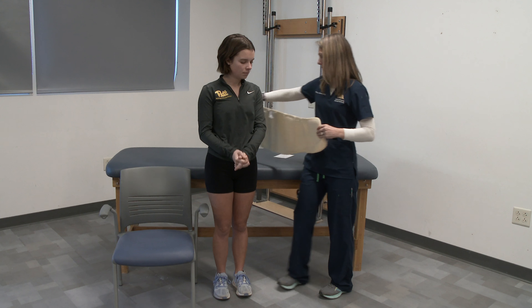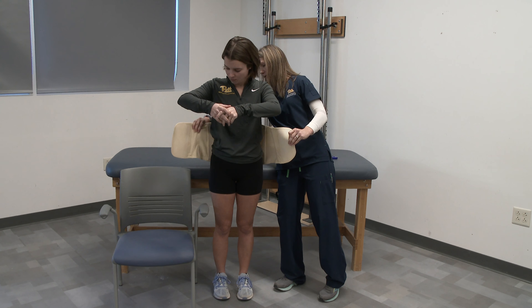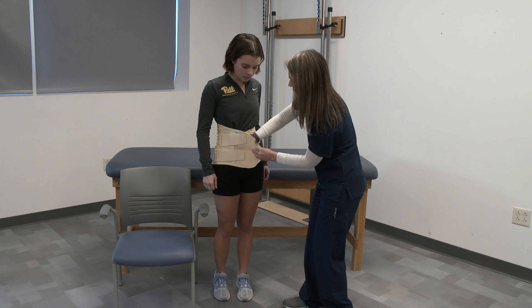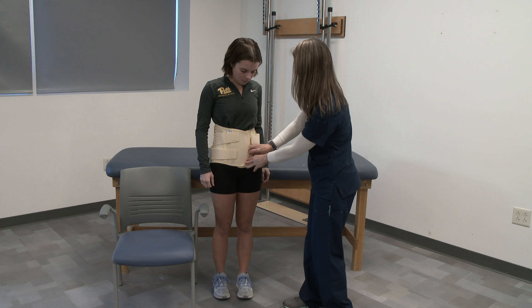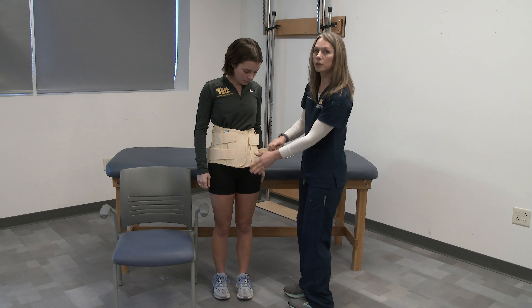Next, you will follow the manufacturer's guidelines and choose the correct size. Once you have chosen the correct size, open up the brace. Make sure that the laces are loose and that you can pull the brace apart.